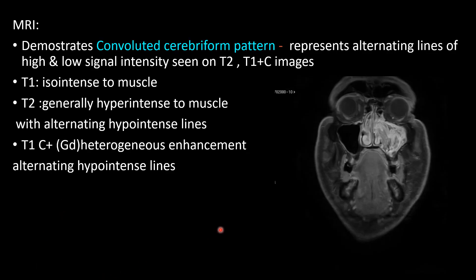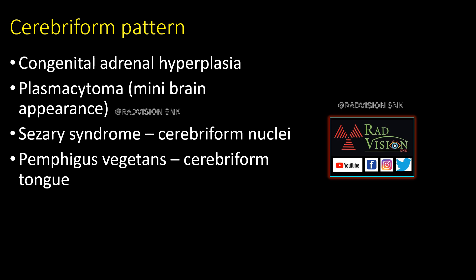On MRI, the lesion is iso-intense to muscle on T1-weighted images. It demonstrates a convoluted cerebriform pattern representing alternating lines of high and low signal, seen on T2 and T1 post-contrast images. The term cerebriform pattern is also used in congenital adrenal hyperplasia, plasmacytoma (mini brain appearance), Sezary syndrome (cerebriform nuclei), and pemphigus vegetans (cerebriform tongue).